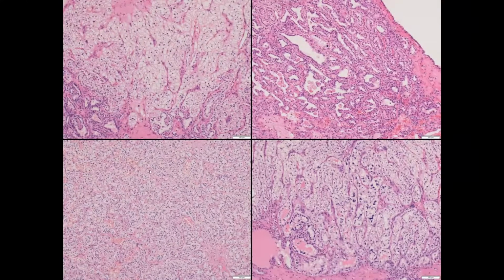But the common theme in all these pictures is that if you look carefully, at least in some places, you should find the peculiar nuclear arrangement. For example, here you can see the linear arrangement towards the luminal aspect. In this one, you can see it in several places over here. And also in this gland over here, you can see that arrangement. And even in these nests, if you look carefully, you will see that many areas in the nest have this type of luminal arrangement of the nuclei, and it's obvious in this case as well.